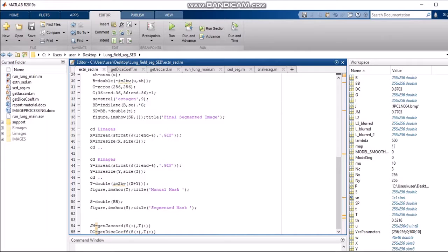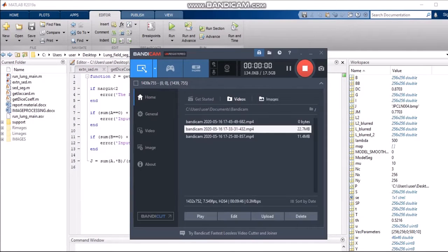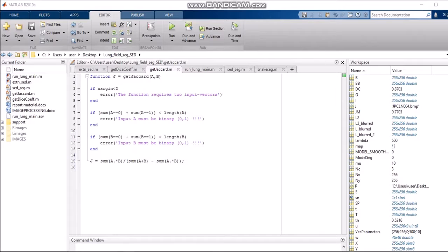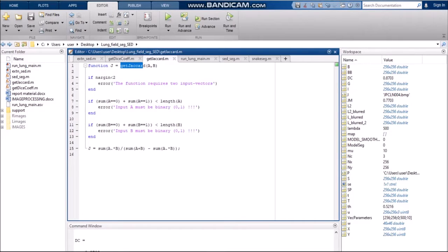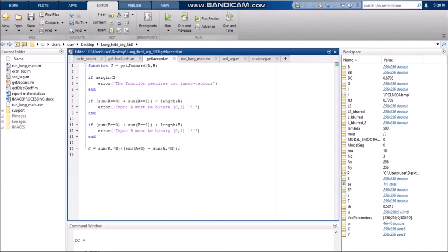When this manual mask is converted to black and white, it gives us the segmented mask. Similarly, we are calculating the Jaccard index and Dice coefficient for this as well. We are getting the get_jaccard function. The get_jaccard and get_dice_coefficient functions have the parameters S and T, which are the manual mask and the segmented mask in predefined calculation.